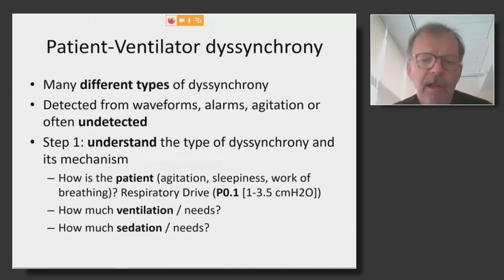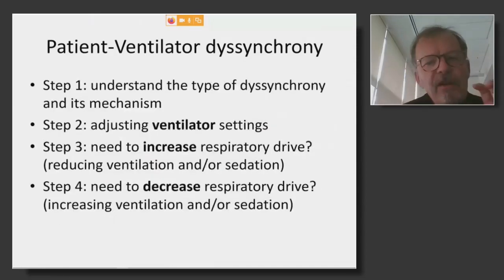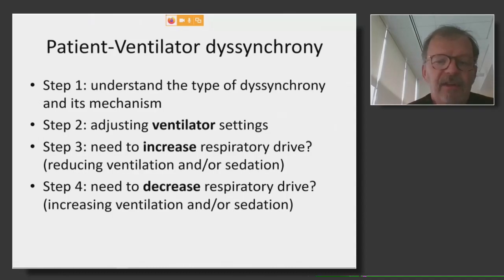And of course, when I say too much or not enough, it is with regard to the respiratory drive of the patient. After you understand the mechanism, then you adjust the ventilatory settings and you answer the question whether you need to increase the respiratory drive by decreasing ventilation or sedation, or decrease the respiratory drive by increasing ventilation or sedation. It may look complicated, but you will see there are very different situations and you will understand what it means.